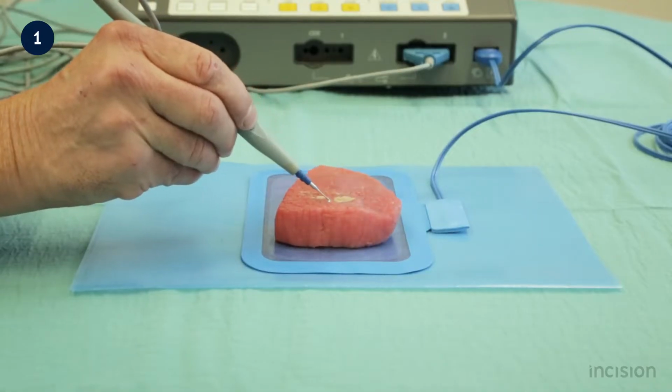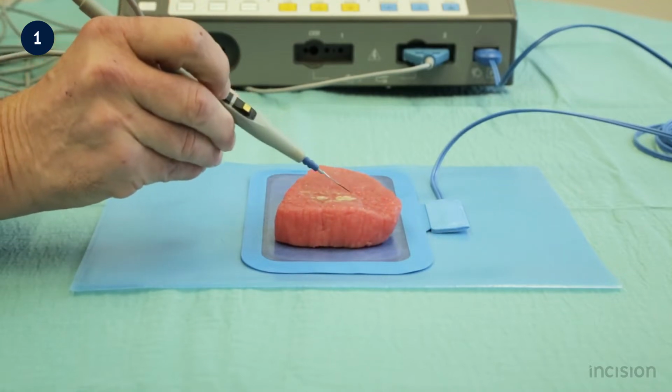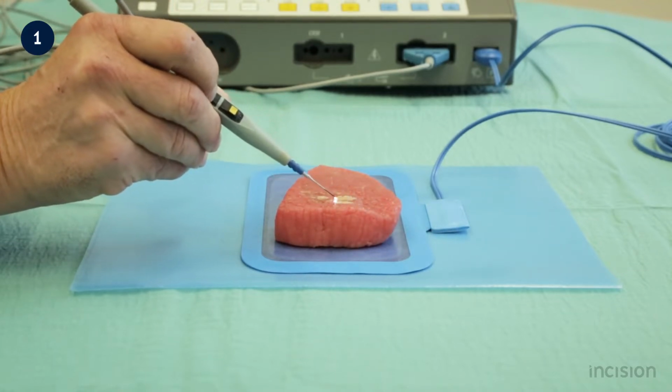The term surgical diathermy is an alternative name for electrosurgery. Before the advent of electrosurgery, cautery referred to the practice of applying a hot implement to a bleeding wound to cause hemostasis. This form of cautery is still in use as a handheld pencil made of resistant metal wire through which current is passed to generate heat. The pencil can then be applied to the patient. Even though this technique is capable of producing similar cautery effect, it is fundamentally different in that current does not pass through the tissue and there is hardly any control in the amount of heat and its distribution.